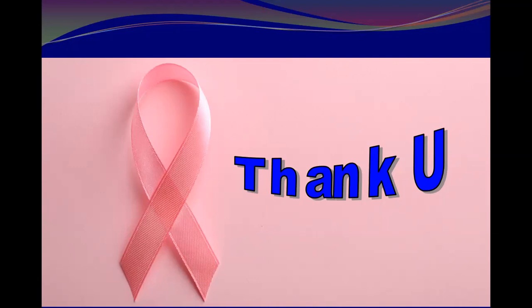The parenchyma is tented toward the skin, and due to the effect of fibrosis, it can pull the superficial layer or even the skin. But sometimes no need to pull.